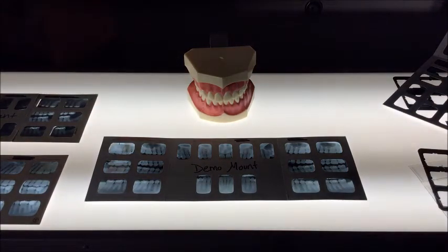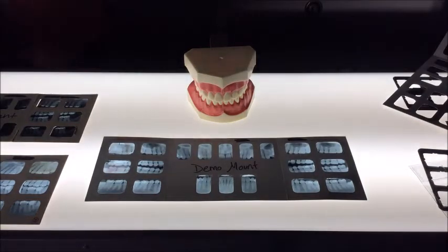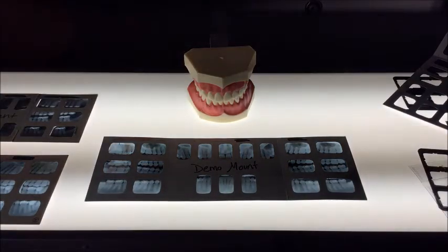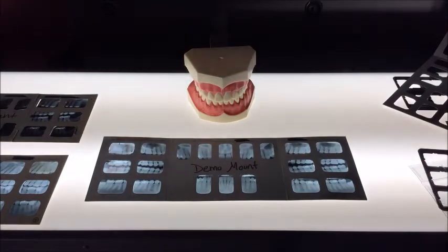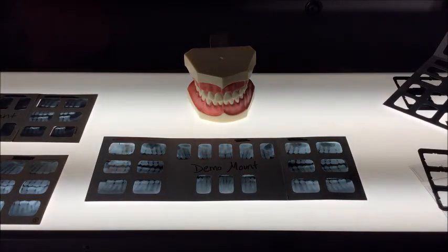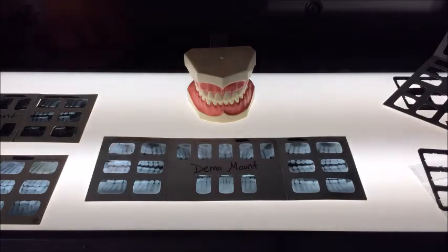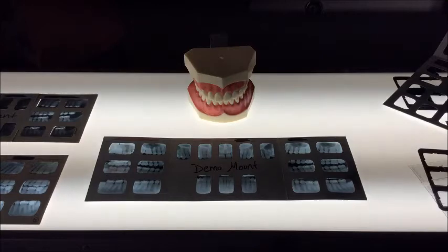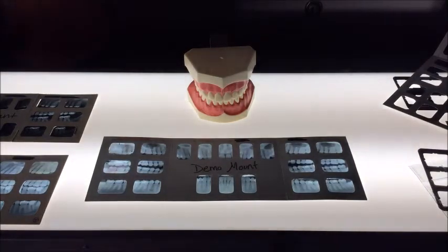Mounting is an important step in the interpretation of dental radiographs. A radiographic image serves as a diagnostic aid that helps the dentist or provider to analyze the patient's level of dental health and/or disease. Dental radiographs that are mounted in correct anatomical order allow for a more thorough and systematic interpretation. So the purpose of this video is to describe a step-by-step procedure for mounting and viewing dental radiographs.